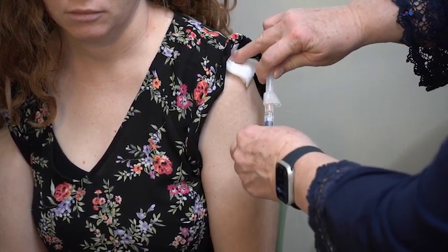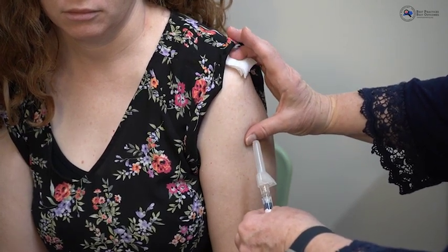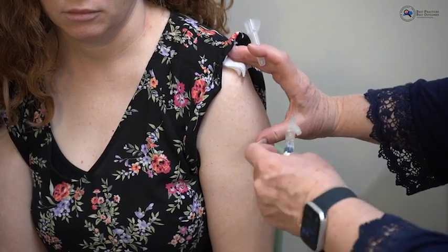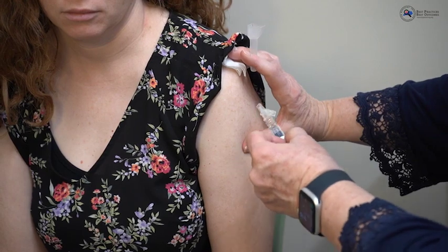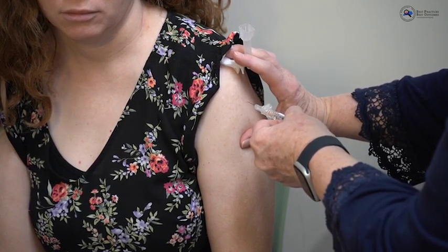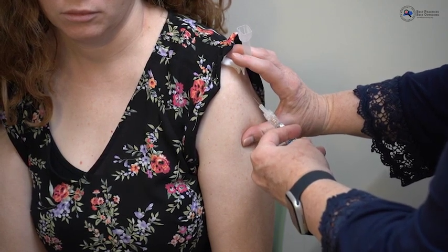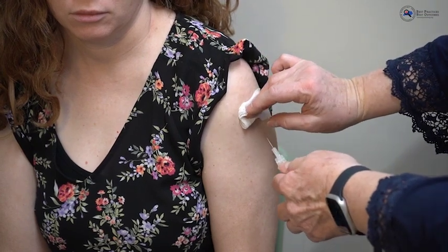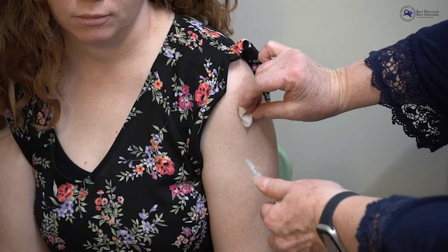Keep your finger on the landmark to clearly identify where to administer the vaccine, and keep your hand directly on the patient. Remove the needle cap only when immediately ready to use it. If needed, pull the tissue taut. Go directly at a 90-degree angle. The needle will go all the way to the hub — especially for smaller children using a 5/8-inch or 1-inch needle. Inject the vaccine completely; aspiration is not required but can be done. Pull the needle out, move your 2x2 into place, and activate the safety device using a one-handed method simultaneously, protecting both patient and yourself. Then apply the Band-Aid.